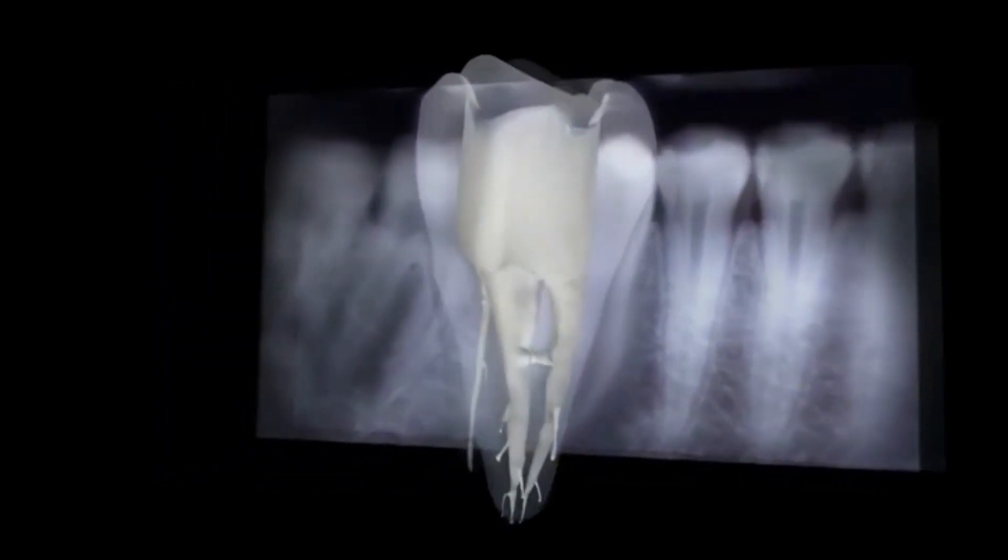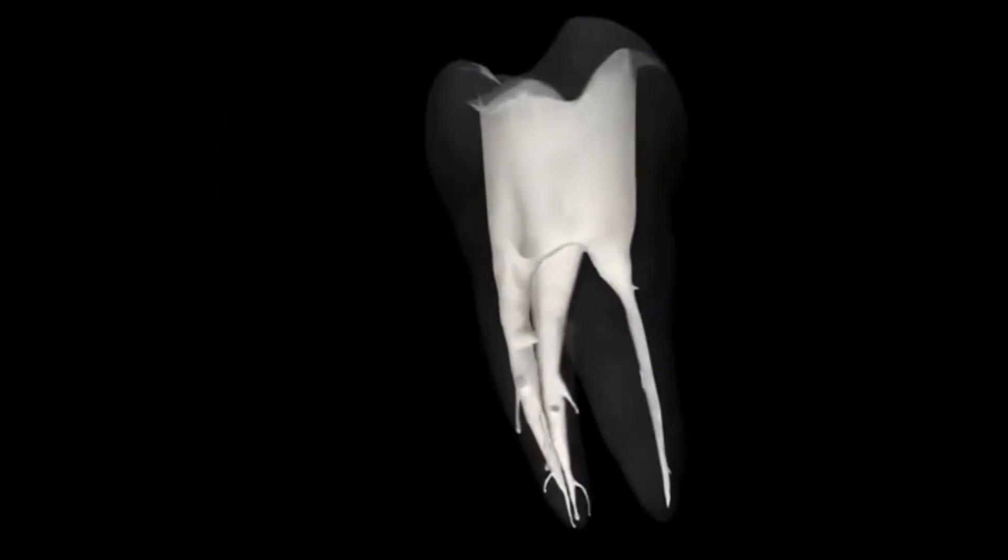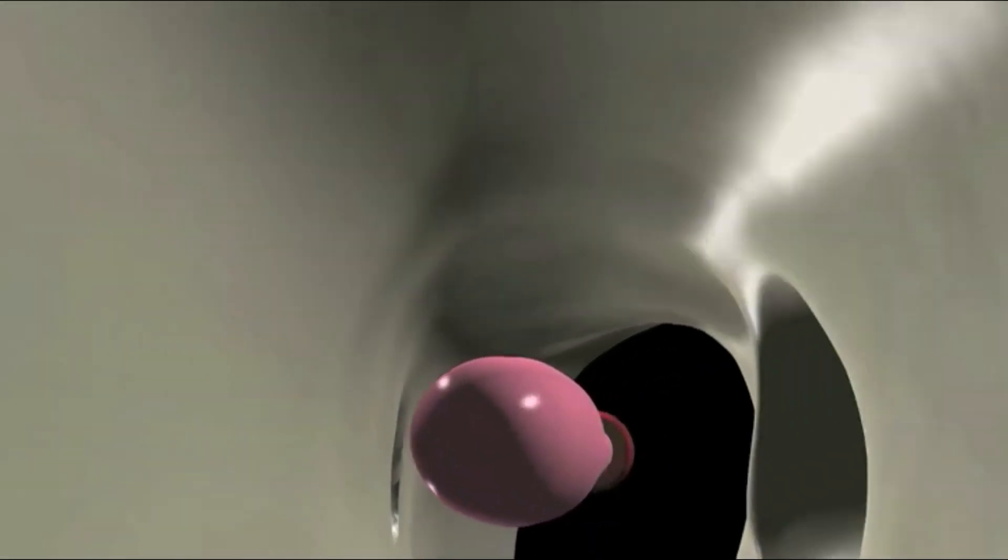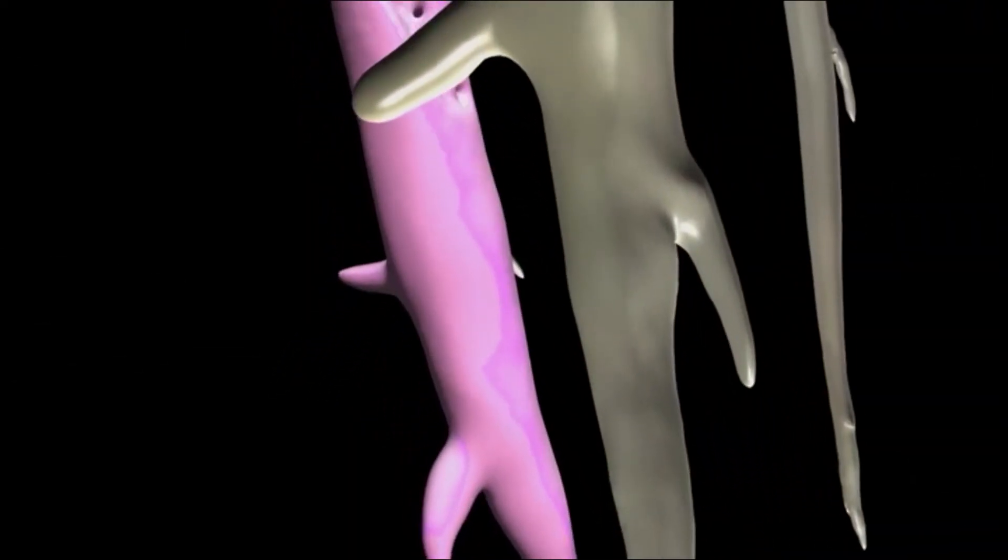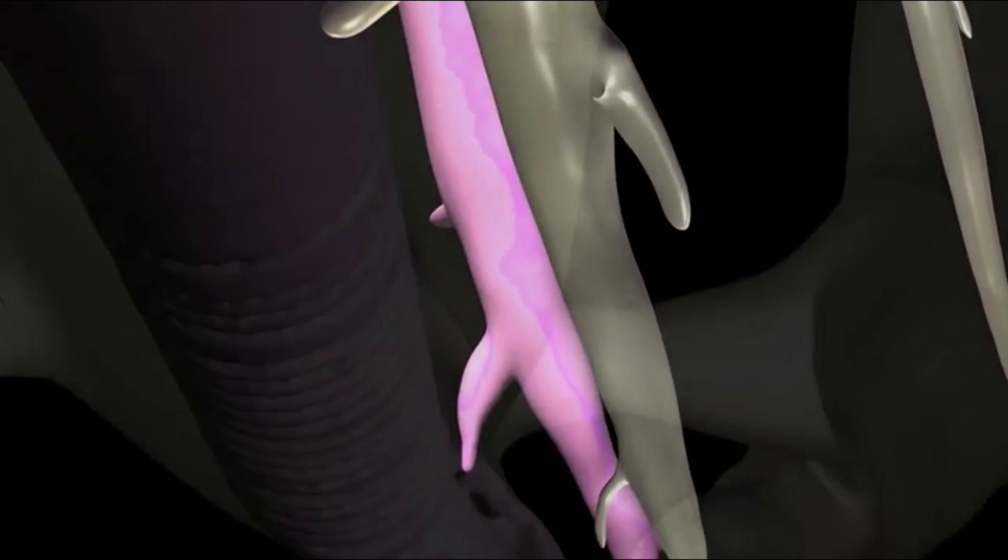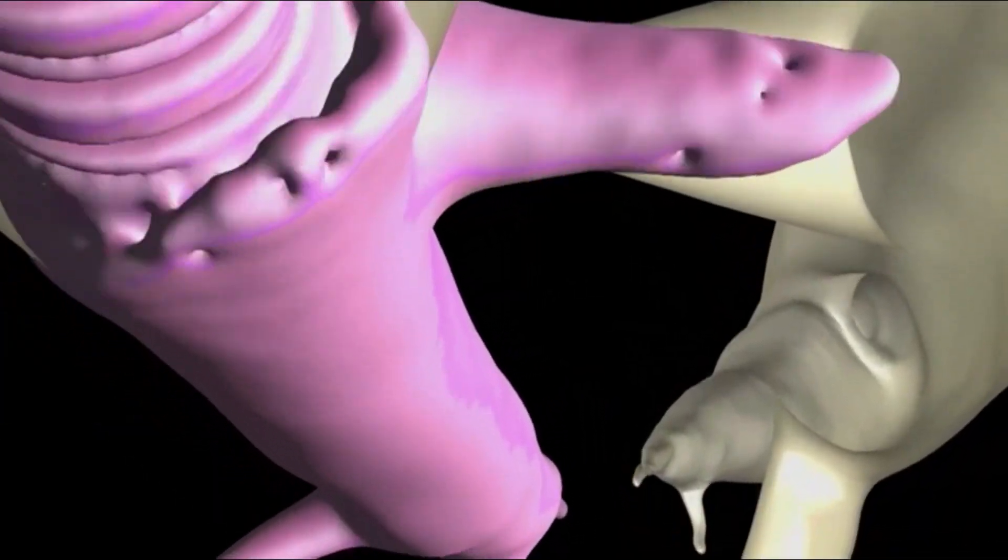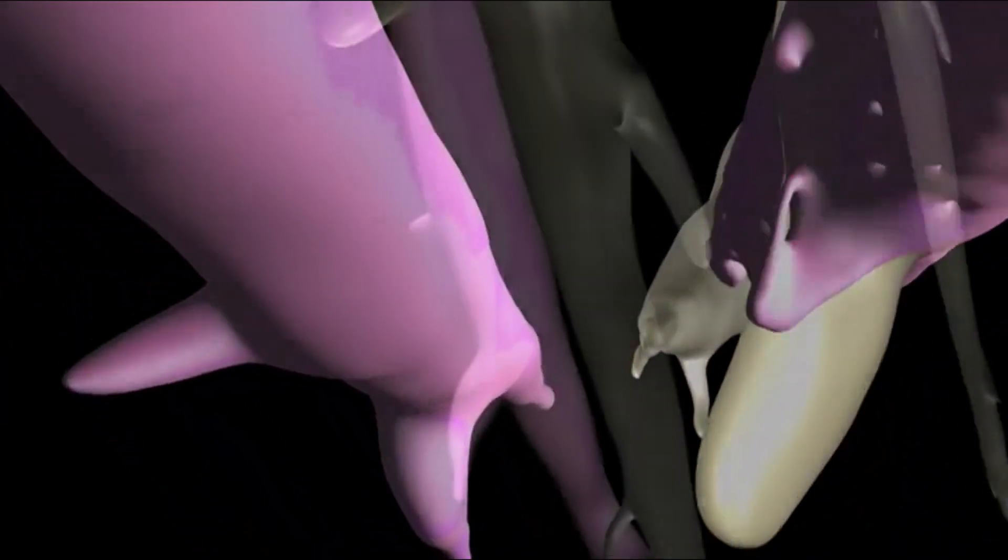Place GuttaCore into the root canal system in one smooth motion without excessive force. The cross-linked Gutta-percha core centrally compacts the alpha-phase Gutta-percha with a hydraulic force that sends it flowing in three dimensions into laterals, isthmuses, and accessory canals.